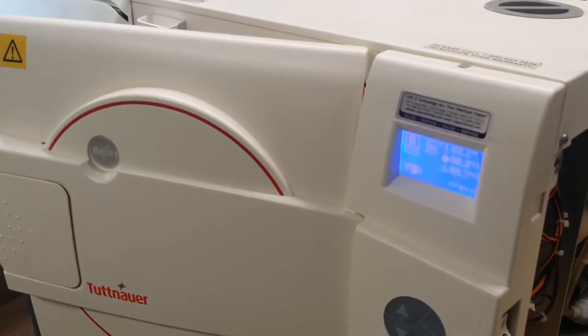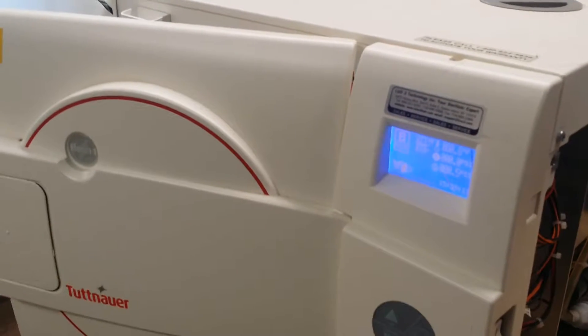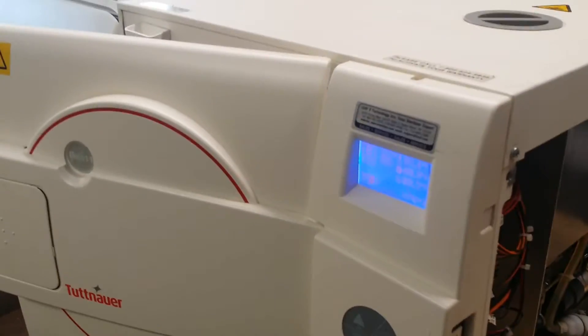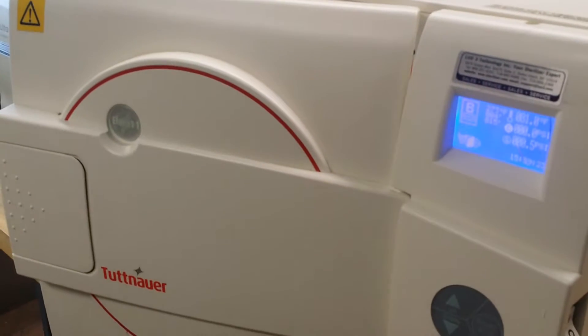Good afternoon. Welcome to iSterilizer.com Technical Support. My name is James. Today, this video will show you how to repair the Tuttnauer Elara 11 sterilizer.